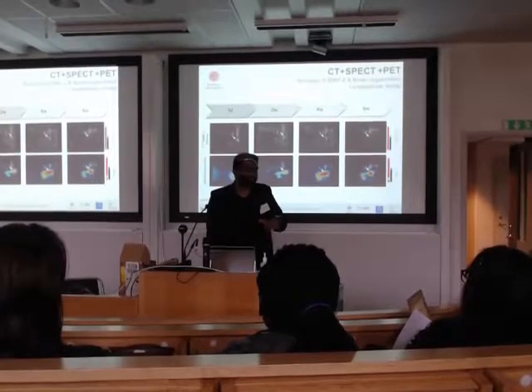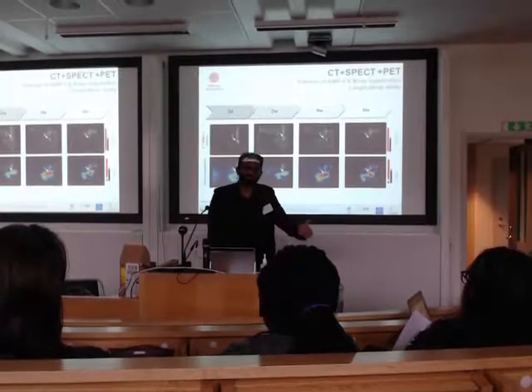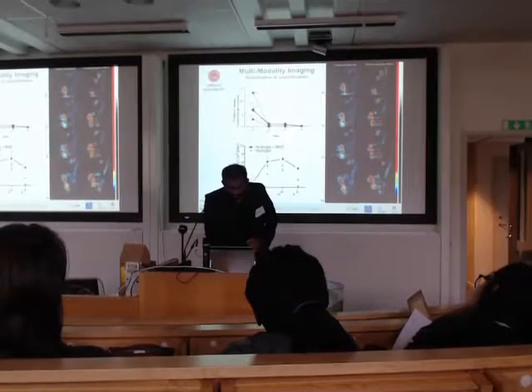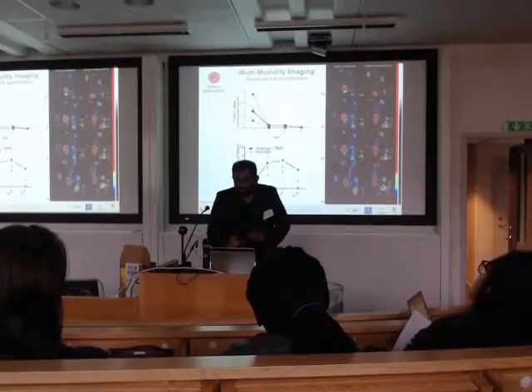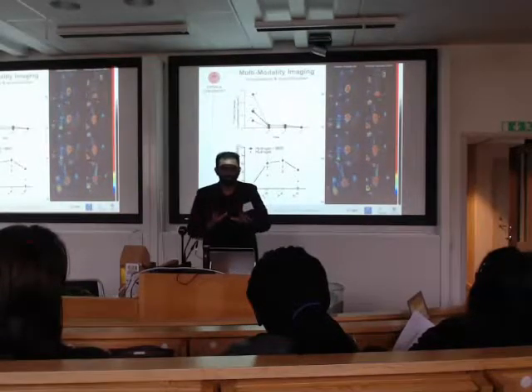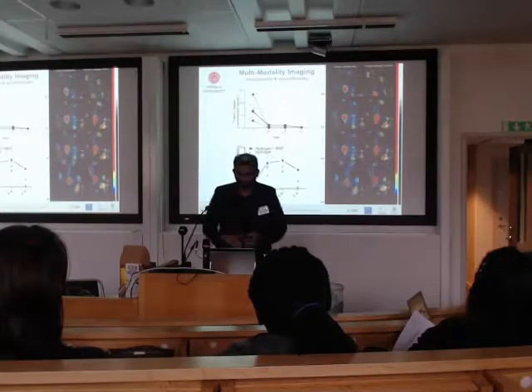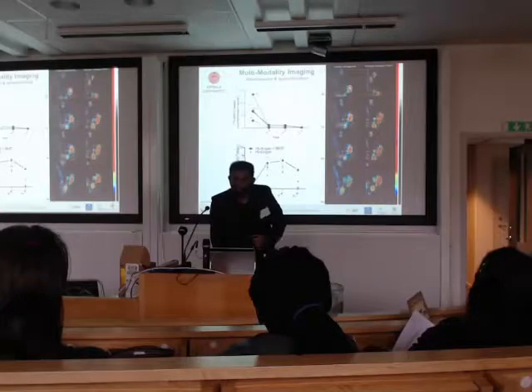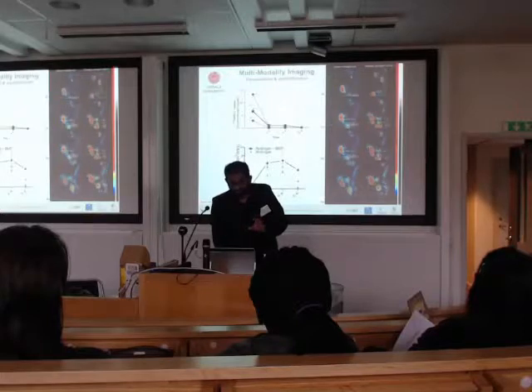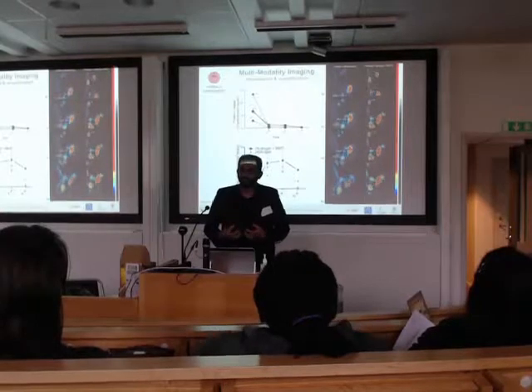Now, as for now, I'm just showing you the principal animals. We also have the control animals. You should have a reference to compare what is working or not. So please pay attention. This blob is a urinary bladder, just to give an idea that this is a live animal. It is sedated, it's anesthetized, but we are working on a live subject. So this is molecular imaging. On the left, you have the control animals, which just have the carrier but don't have any protein, but the principal group carries the protein, where you should see a relatively faster bone regeneration.